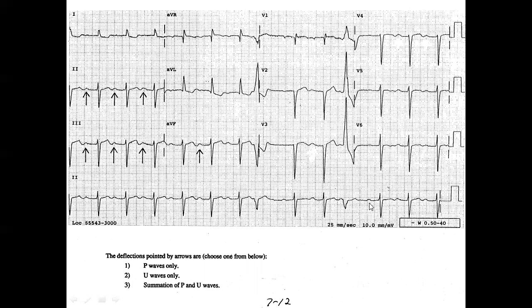It has to be a P, not a U. But this is a little bulkier than this one. This is a little bit bulkier than this one. Is there a U added on top of it? You can only speculate, but you cannot be certain. Now you need help from the patient. What are you going to make out of it?